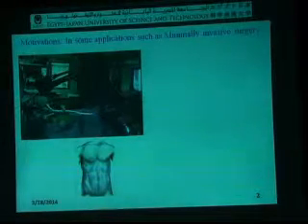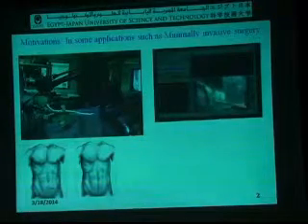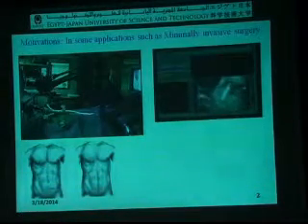Our motivation for this work is in some applications, such as minimally invasive surgery. Such a surgery is done through some hole, and the hand of the surgeon is outside the abdominal wall of the patient. This is to avoid open wound or open surgery and replace it by a small incision, for reducing trauma and reducing the healing time. The problem of such surgery is that the tool itself is a piece of steel, so the surgeon cannot feel inside the abdominal wall.